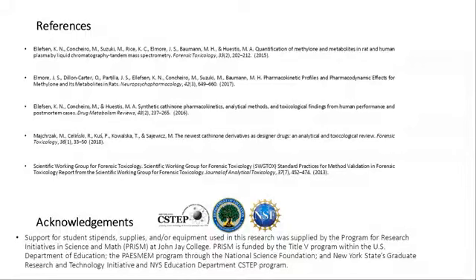Well, the literature has shown different methods for methylone based on LCMS. However, this method was created as a very unique method, designed specifically for identification and quantification of this drug in rat brain. But in order to be useful for other biological specimens and other techniques, it needs to be reevaluated for the whole method based on the type of biological sample, such as urine or blood. And we have to reconsider all the parameters again, LCMS and sample preparation.